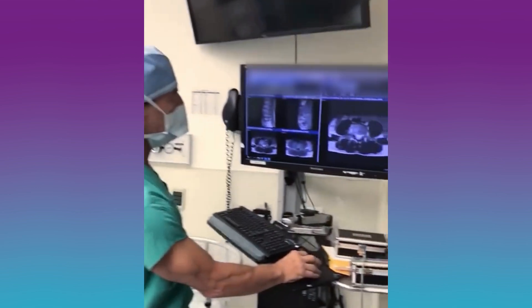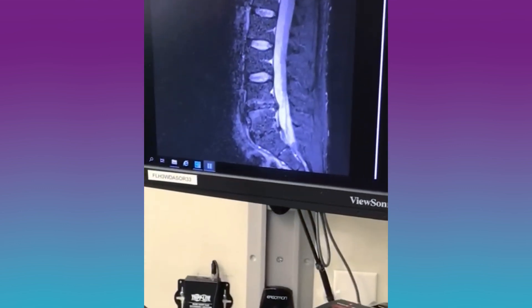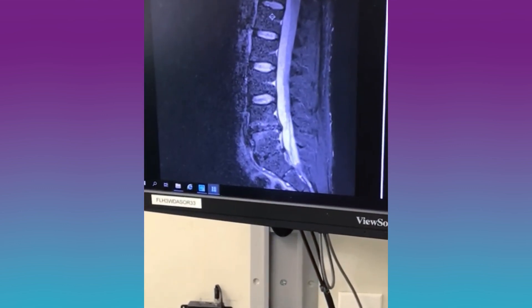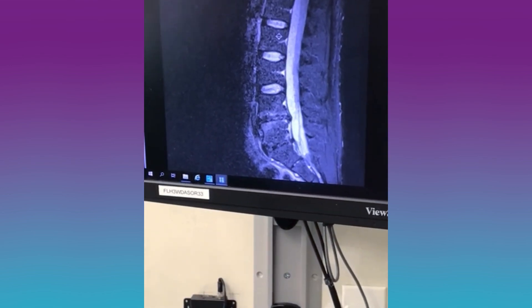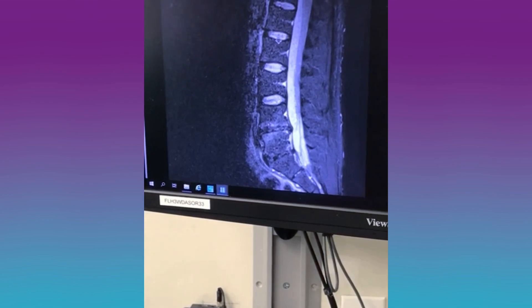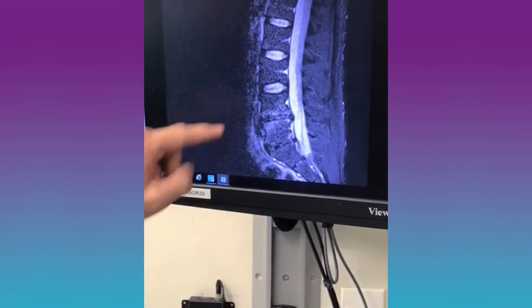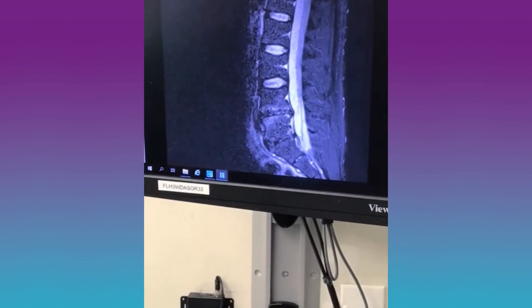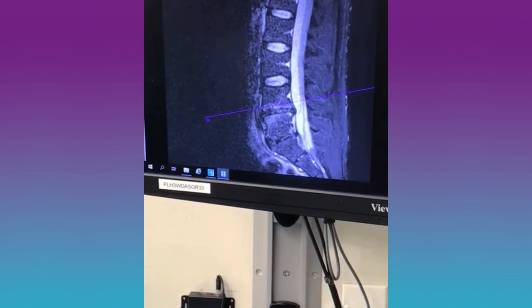If you look at these pictures, you can see normal joints in this area — the bone, the disc. The disc is white, large, and full of fluid; the white color represents fluid. As the disc degenerates, it goes from white to a darker color. You can see all of the upper discs are normal, and as we get to this lower area the discs are severely degenerated. You can also see the white halo around each of these discs, which is visible swelling.